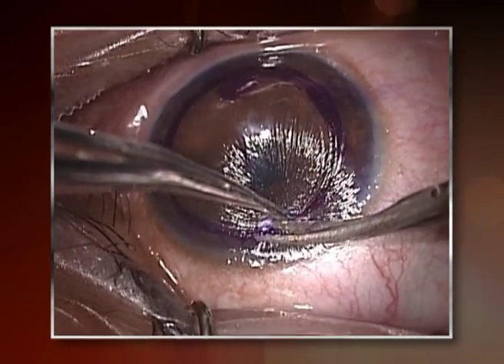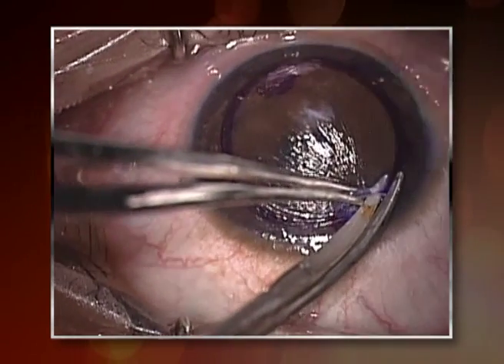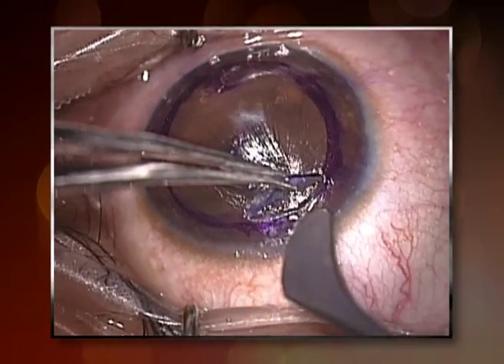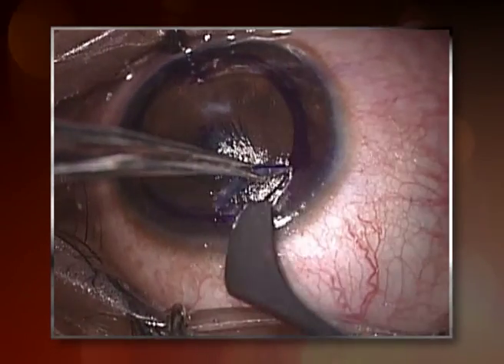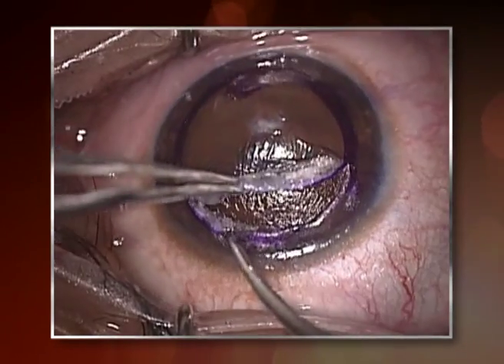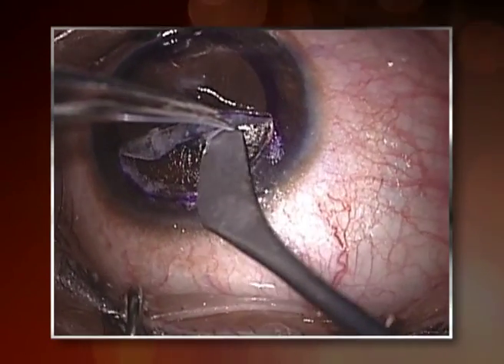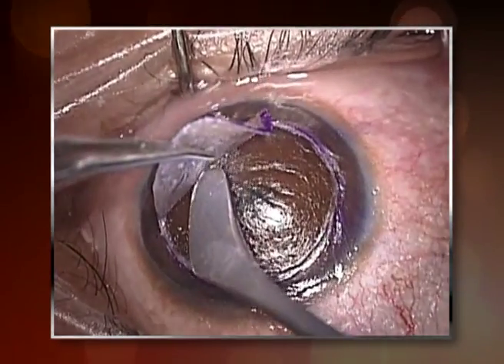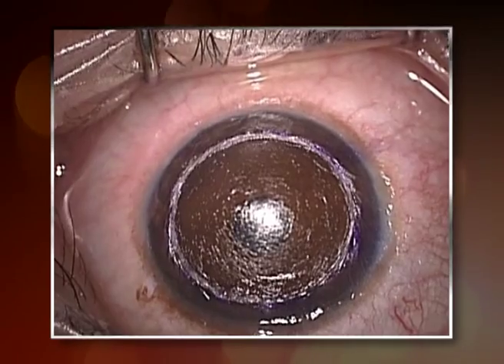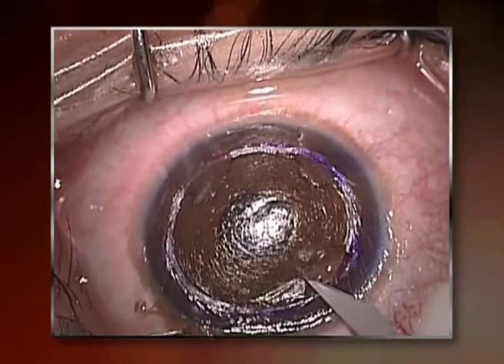Medium curved fine blade scissors are then used to extend the incision on either side circumferentially all around. An open centripetal lamellar dissection is carried out using lamellar dissectors under direct visualization. The central stromal disc is then excised, leaving a very thin residual stromal bed. Cone compression is then done to flatten the cone in the residual bed by giving stab incisions.